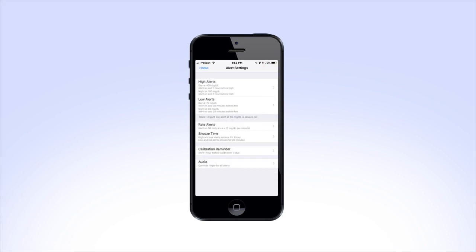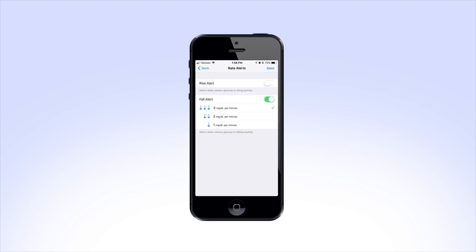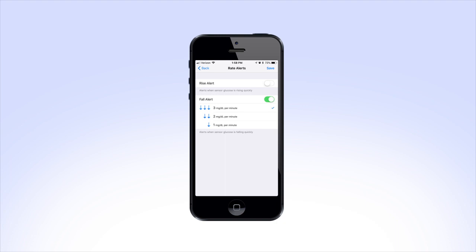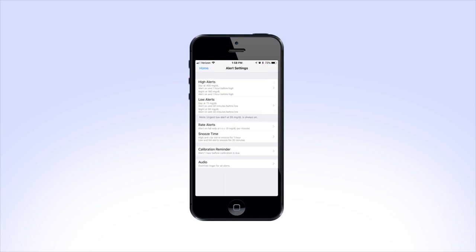If your health care provider has prescribed the rise or fall rate alerts, tap on Rate Alerts. Here you will see the options to set your rise rate and fall rate. These settings will alert you when your glucose is rising or falling at a rate you set. Your health care provider will work with you to decide what your settings should be. After you are done setting your rate alerts, tap Save.